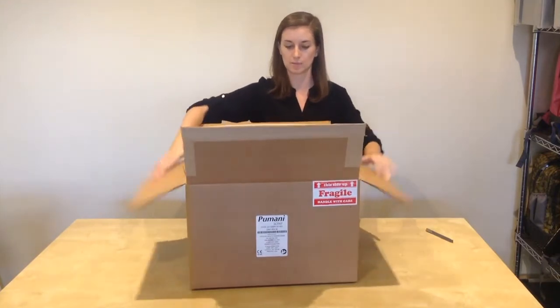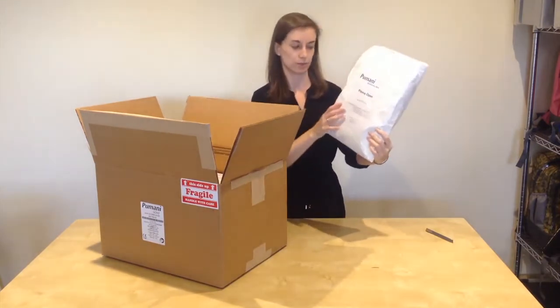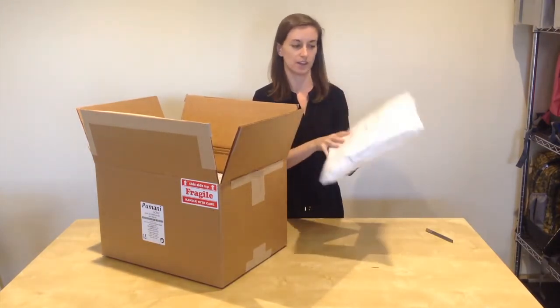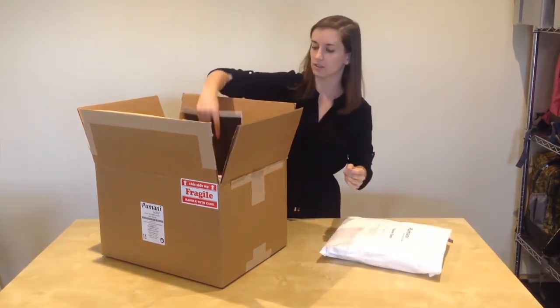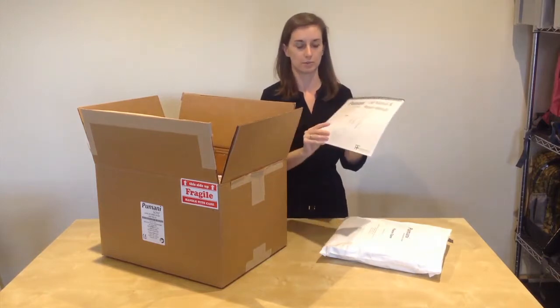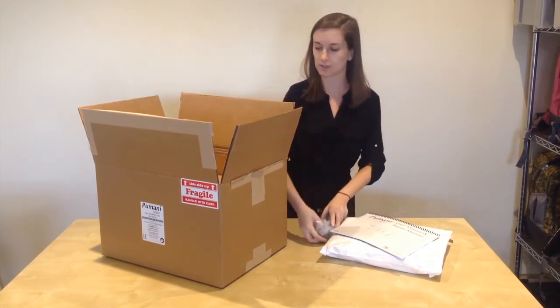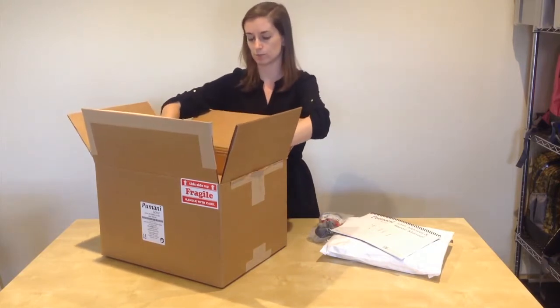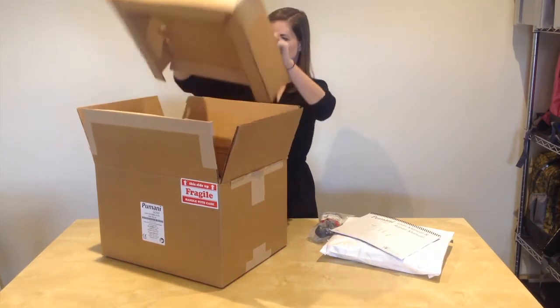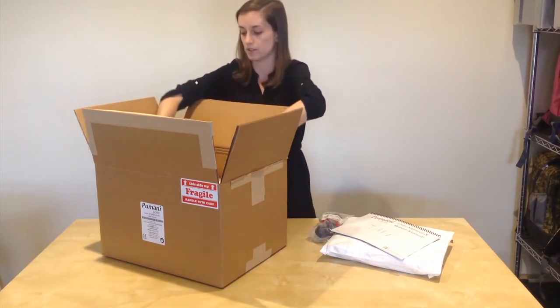Once you've opened your box, you will see on the top there is an accessories pack, which we call the starter kit, and this has a set of accessories that come in the box. Underneath the accessories pack is the user manual and repair manual. You'll also have your power cord in the box, and then you'll have your Pumani unit. Remove the inserts and pull out your Pumani unit.